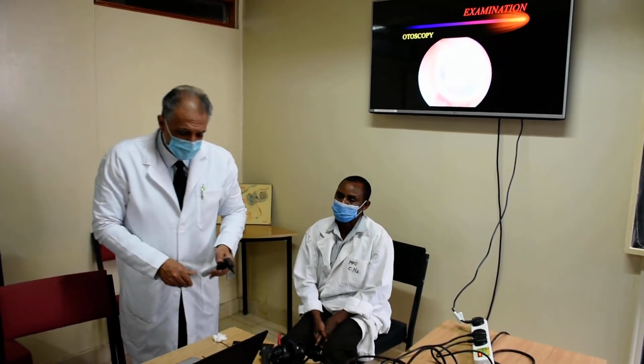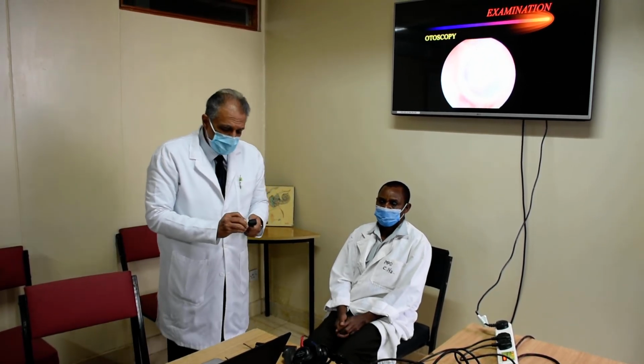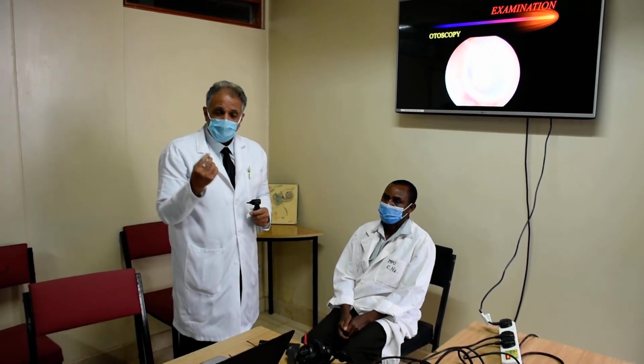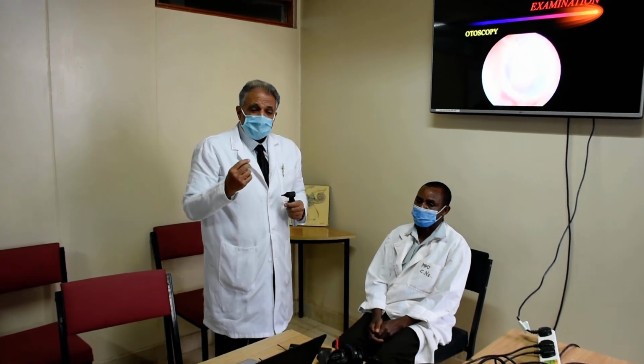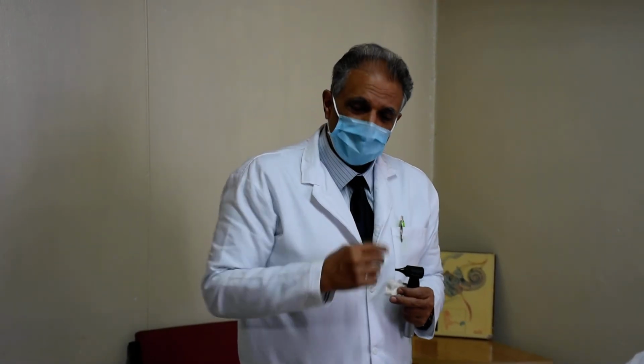Otoscopy then completes the assessment of hearing, and by that time you should know, does your client have hearing loss? If he does have hearing loss, what type of hearing loss? Is it conductive, sensorineural, or is it mixed? You should also know what is the amount of hearing loss. Is it mild, moderate, severe, or profound by audiometry?